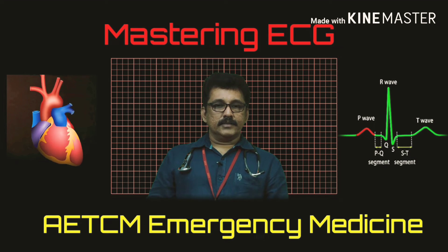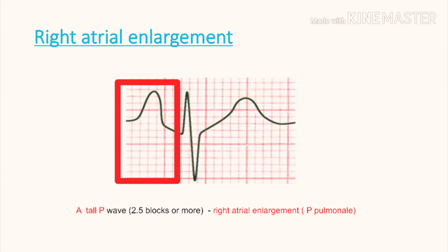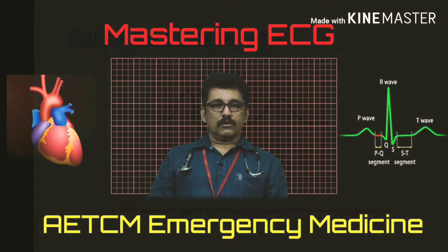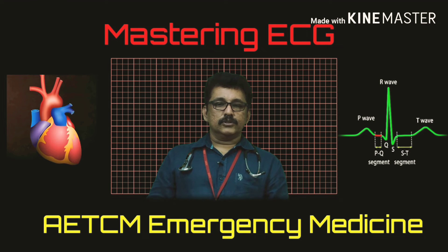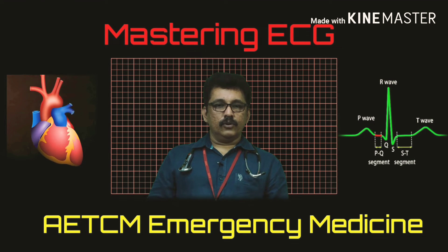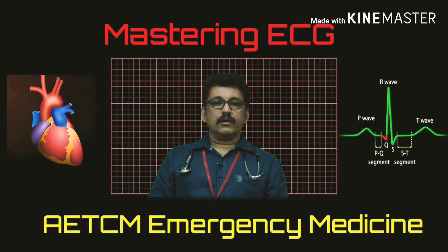This ECG shows very tall P-waves. A tall peaked P-wave is called P-pulmonale. The classical condition producing P-pulmonale is right atrial enlargement. Right atrial enlargement is commonly seen in chronic obstructive pulmonary disease (COPD). A tall peaked P-wave more than 2.5 divisions is a sign of P-pulmonale, classically seen in cor pulmonale or COPD with right atrial enlargement.